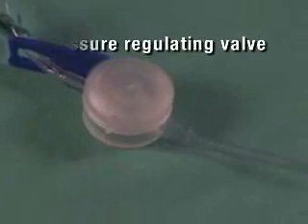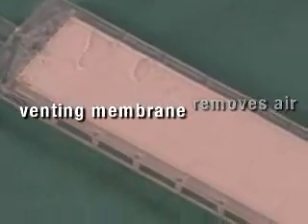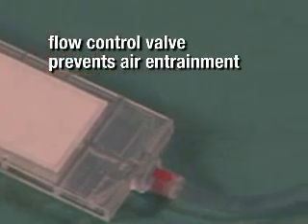It has a built-in pressure regulating valve which prevents excessive line pressure, and contains over 6 square inches of venting membrane to automatically remove air from crystalloid.